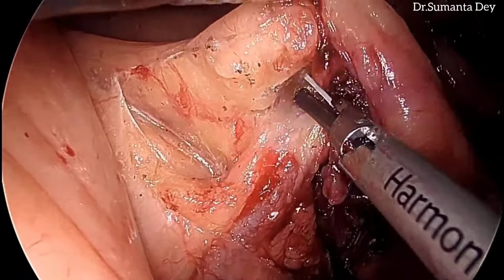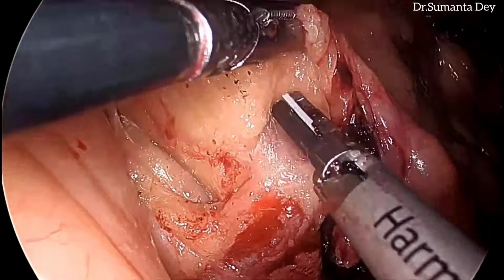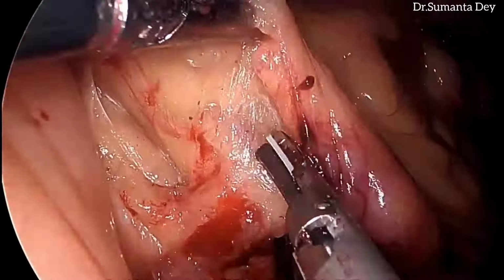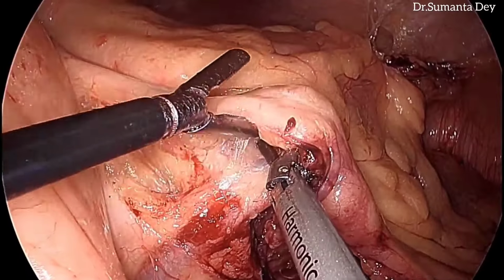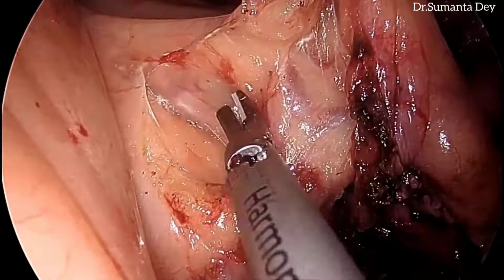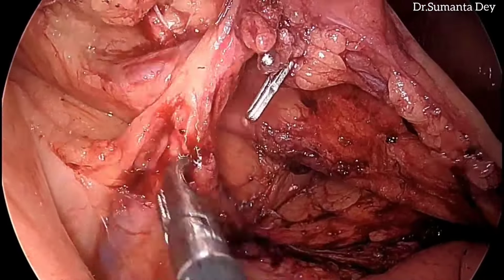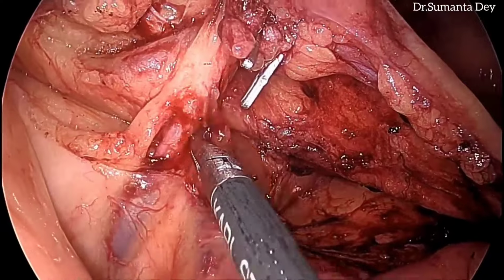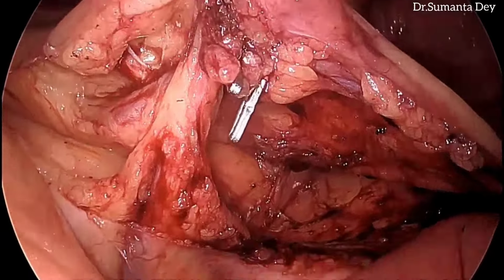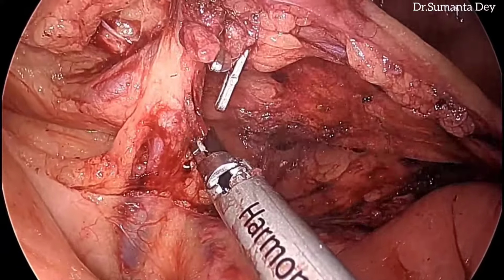Gradually I'll be dissecting the IMV all around, and then we'll be ligating and dividing it. But before that, I'm just checking whether other branches, that is the artery of Moskowitz, which is very close in relation with the inferior mesenteric vein. So this is a plane I am trying to identify, but before that I have decided to dissect the inferior mesenteric vein all around, and then we'll ligate it with the harmonic shear.